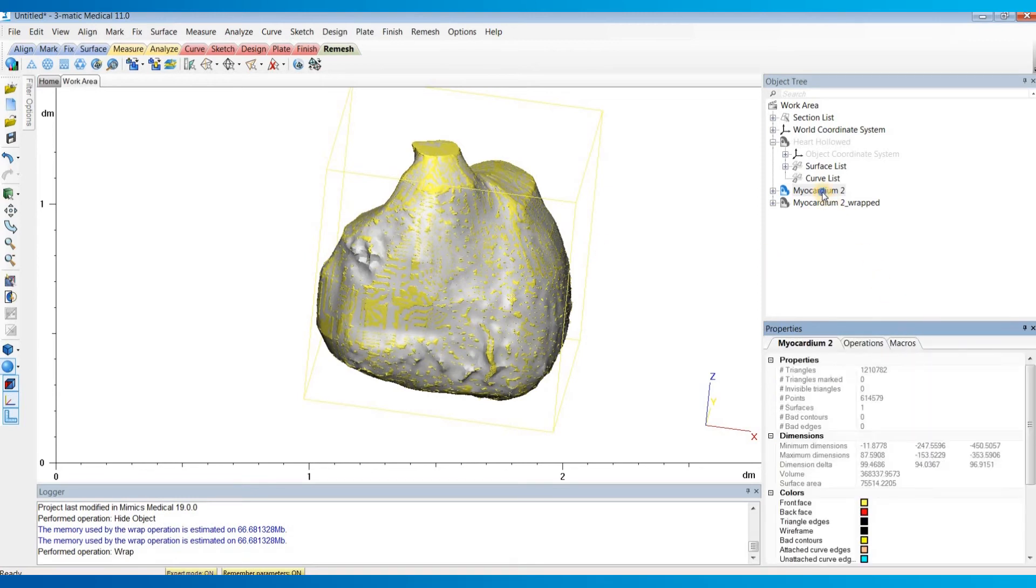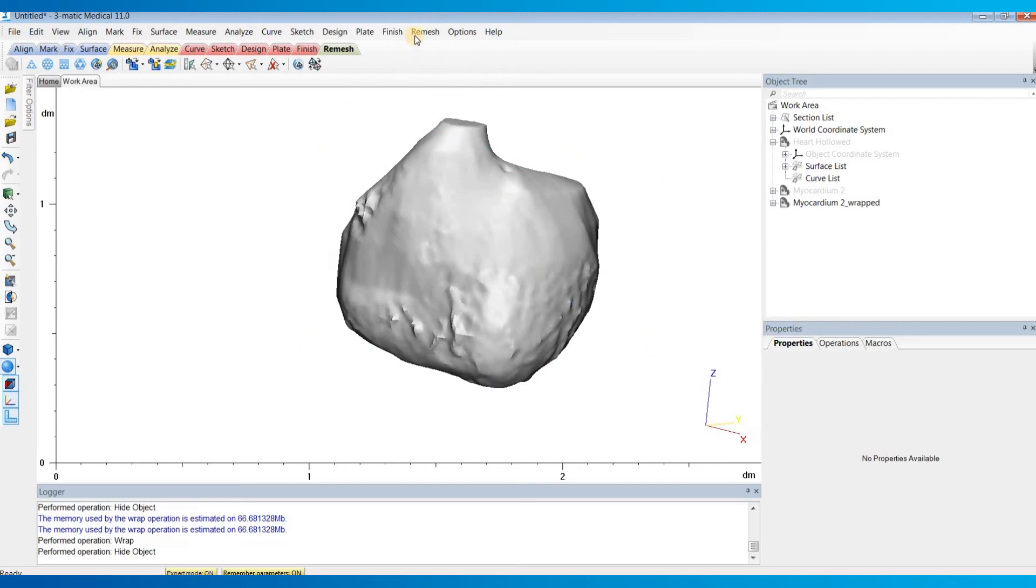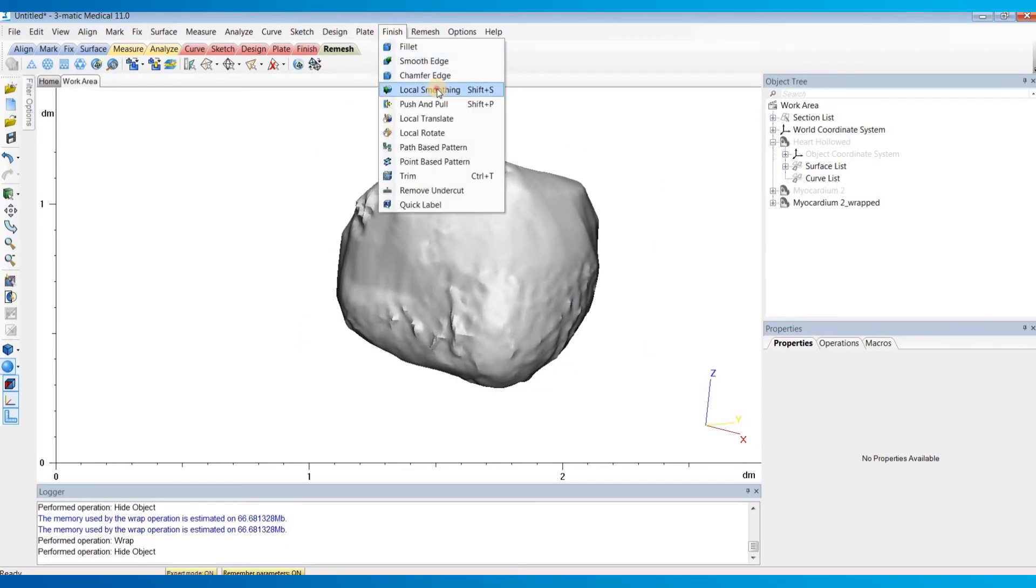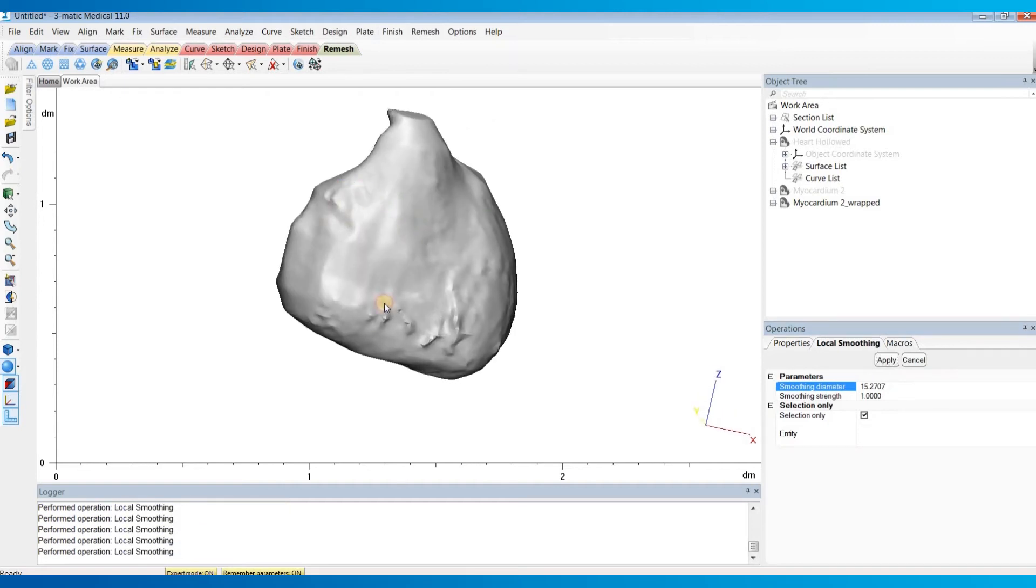Then I'll hide our original myocardium, and now you can see the wrapped version. I'll go under the finish menu and do local smoothing to further smooth out this surface.